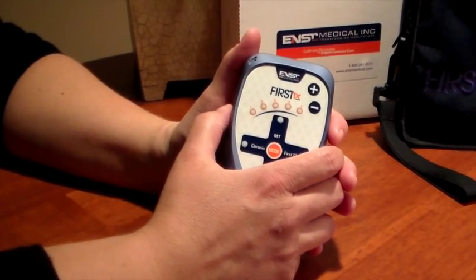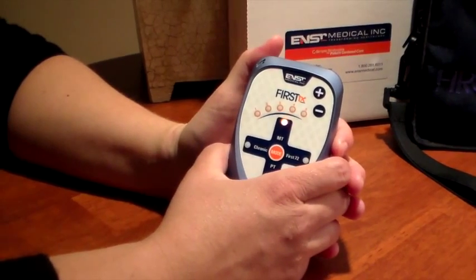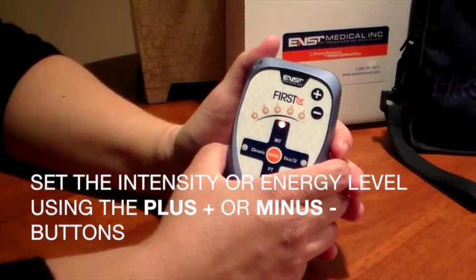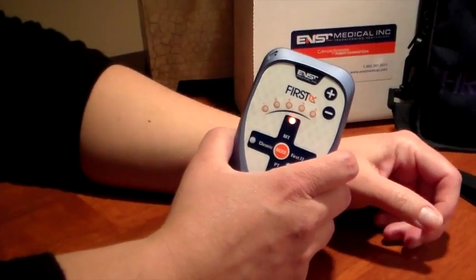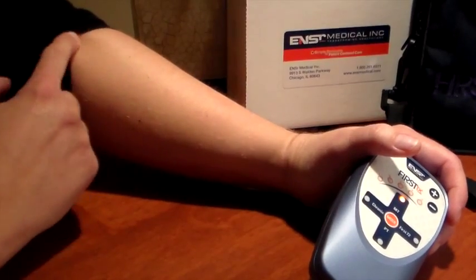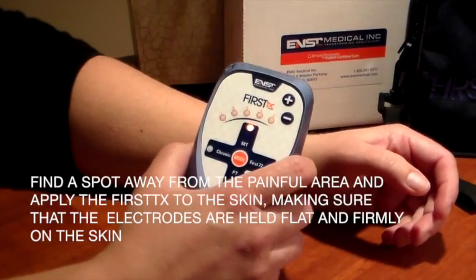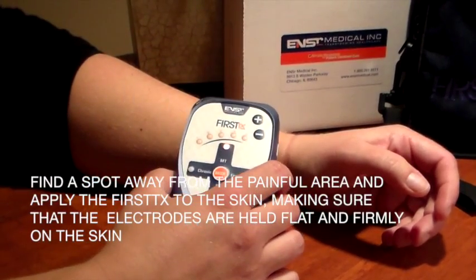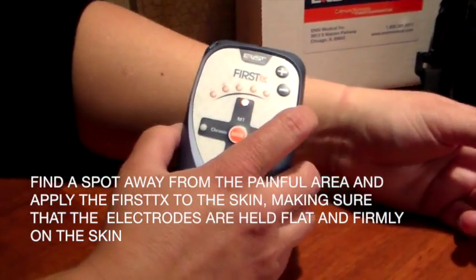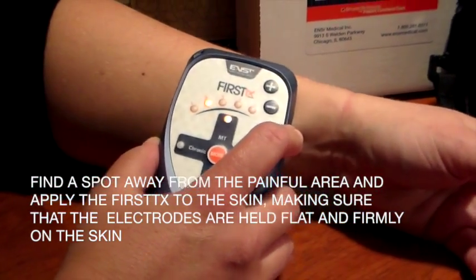Okay, let's get started with the treatment. First, turn the device on. Now what we want to do is set the intensity or energy level for the treatment. I'm going to use my arm as an example. I'm going to say that the area of pain that I have is here. What I'm going to do first is find a spot away from the painful area and apply the device to the skin, making sure that the electrodes are held flat and firm on the skin.